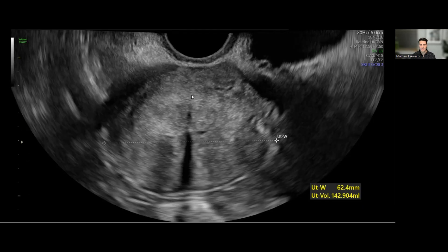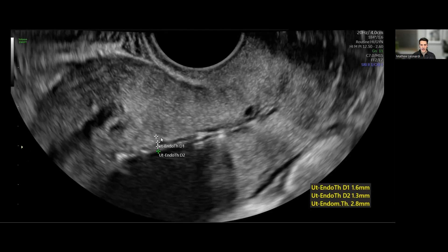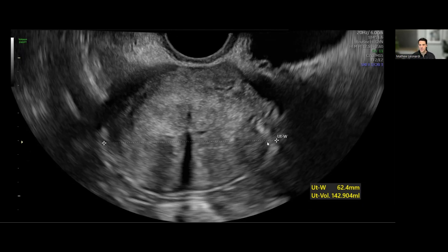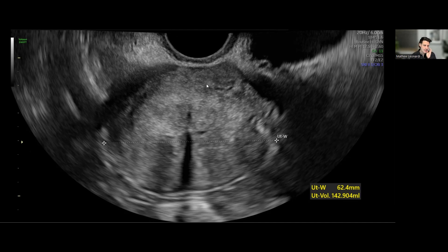Coming back to that endometrial measurement — there's the IUD body and that shadow again. The next image gives us our width of the uterus, which gives us a volume of 142cc — maybe a tiny bit above average, but within normal limits, pretty normal-sized uterus.